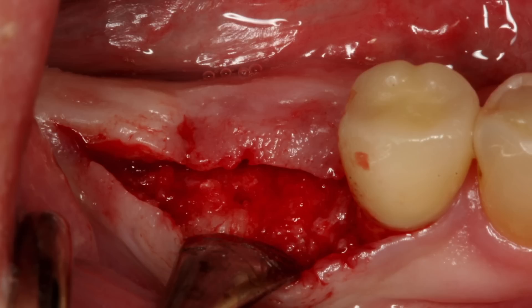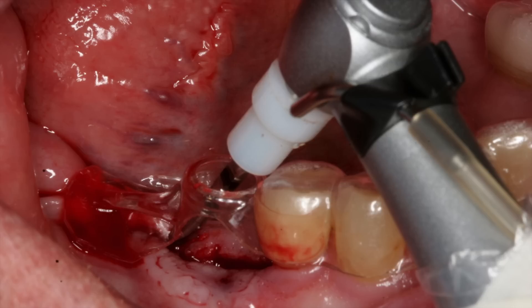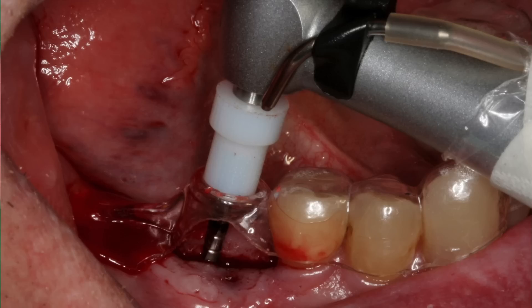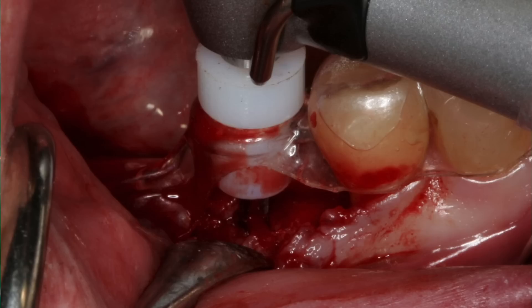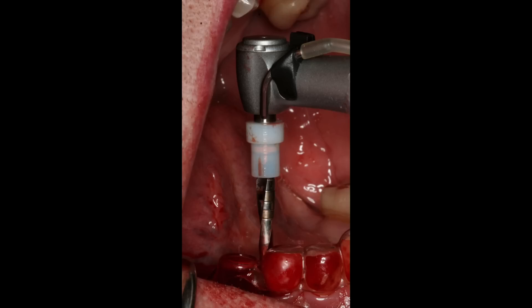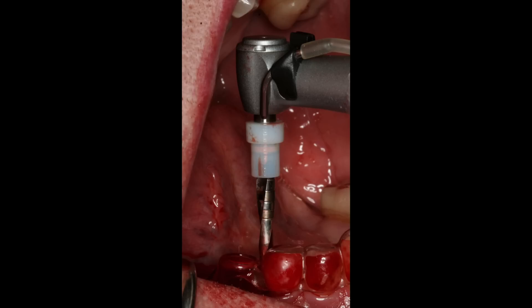A flap is reflected, exposing the pilot hole, creating a 5mm deep pilot hole. Next, a 2mm drill is inserted into the guide at an angle, requiring no more vertical space than freehand drilling. The drill is then rotated upright and the tip placed into the pilot hole. The drill is inserted until the drill stop seats on the rim of the hole, creating an 11.5mm deep osteotomy. This image shows the vertical clearance required if this were a tube guide, where the handpiece and drill must be stacked on top of the tube. Compared with the thin layer guide, tube guides usually require 8-9mm more vertical clearance, which limits their use in posterior sites in many patients.